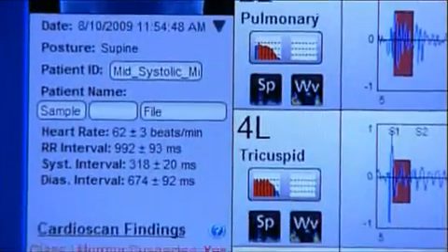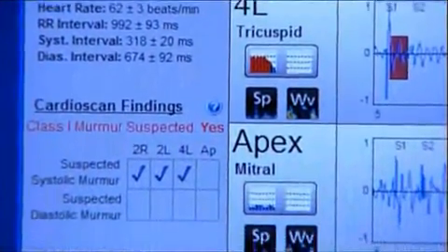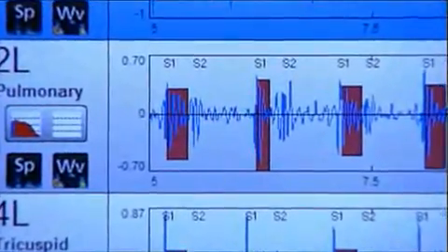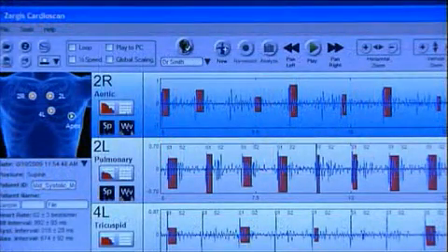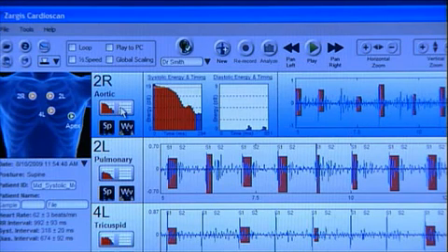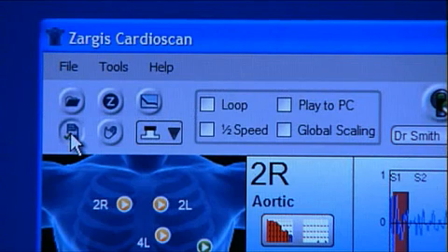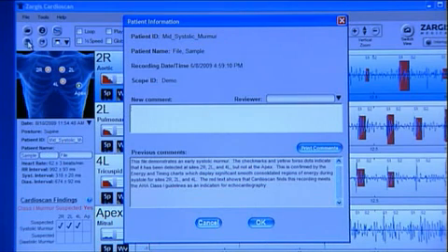Many additional options appear on the detailed screen to view and listen to the recorded sounds. As on the summary view screen, S1 and S2 markings are present for each recording. To launch the systolic and diastolic energy and timing graph for a site recording, click the rectangular icon that appears under the site name. These graphs display the energy, timing, and shape of murmurs. Under this button are the spectrogram and wavelet icons that allow you to view the recordings in the respective graphs. You can enter and or view past comments associated with this sound file by clicking the Patient Information button located at the top left of the software screen.